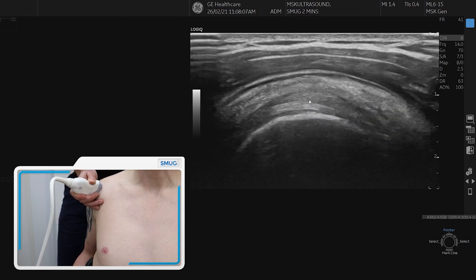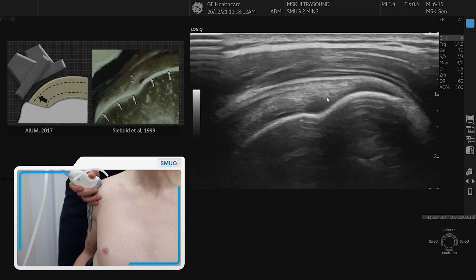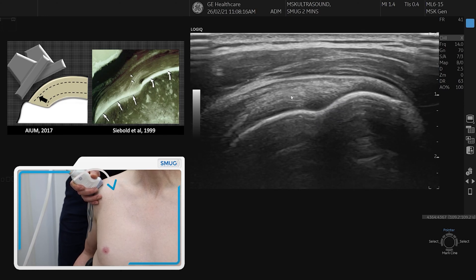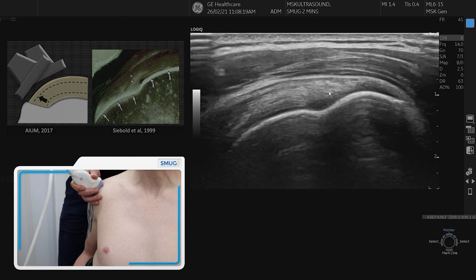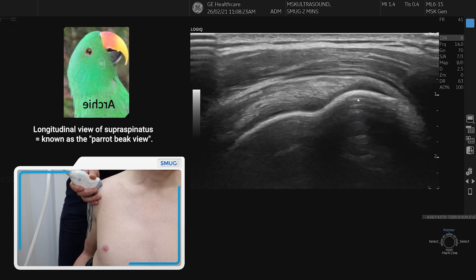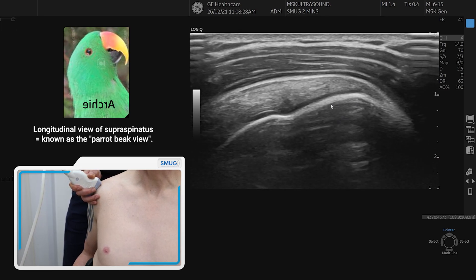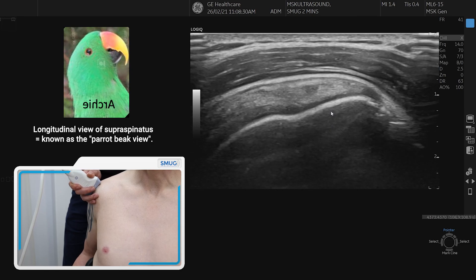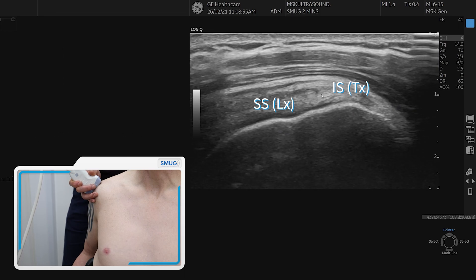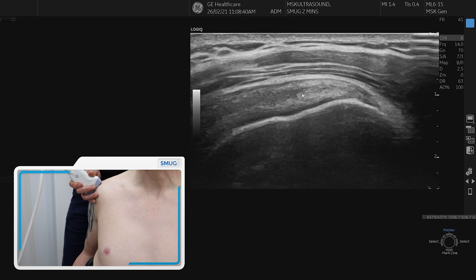If we come back round laterally, we then hit the greater tuberosity. We straighten up by just towing down the probe and there we can see the longitudinal fibres of supraspinatus. We need to ensure that we scan all the way through supraspinatus until we get to infraspinatus, feeling the shape of the bone until the tuberosity flattens out and we see a change in fibre orientation on top of the tuberosity — that's the infraspinatus coming in over the top of supraspinatus in transverse section.